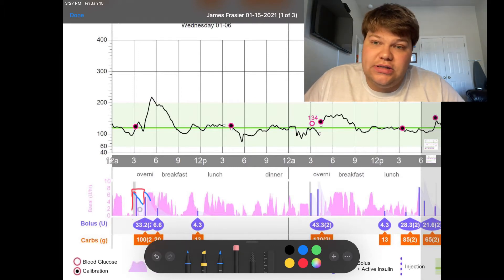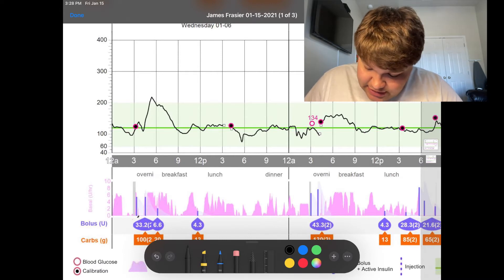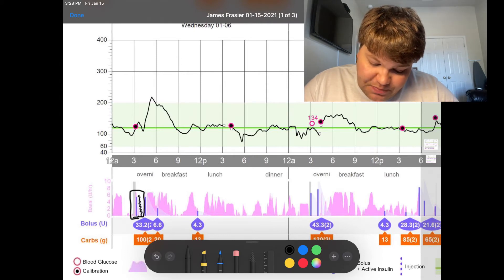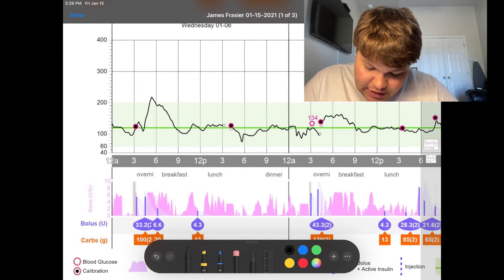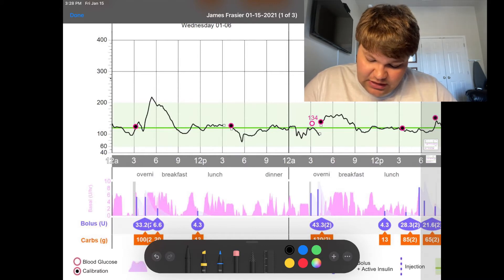Auto mode is not delivering insulin because it's waiting for your body to react to the insulin that you've bolused. You can see the correlation — my blood sugar spiked a little over 220. Then as that insulin starts to wear down on that second bolus for my meal, auto mode ramps back up. Then I do a final touch-up bolus at the end, my third one, which was significantly less than the first two.